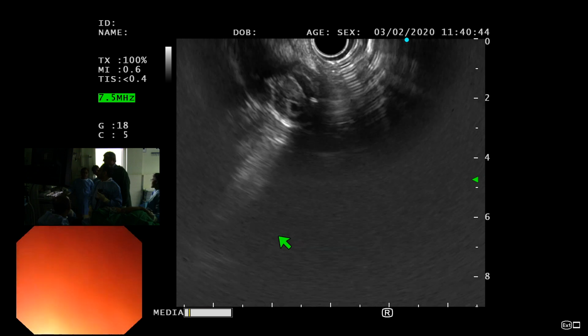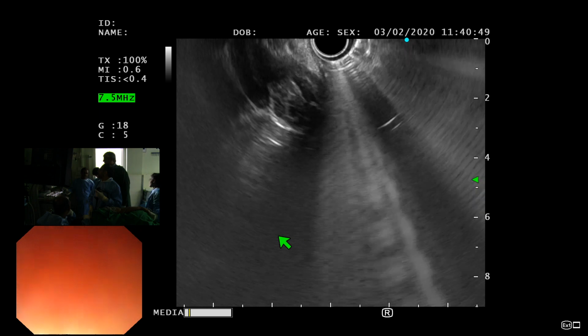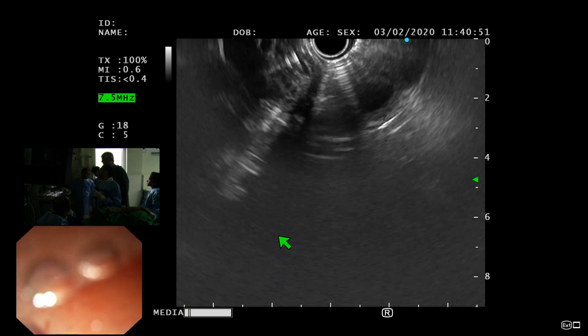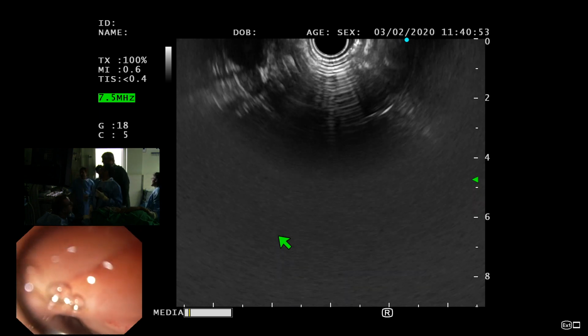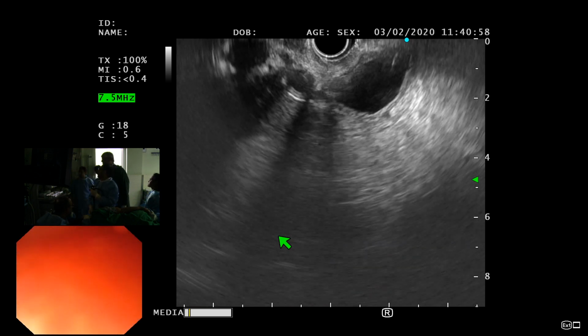So what is the exact size? Did you measure that? No, I will tell you. I'll measure it for you. To be honest, I don't think that was that abnormal, so I didn't pay much attention. To me, my focus is more on the CBD really.